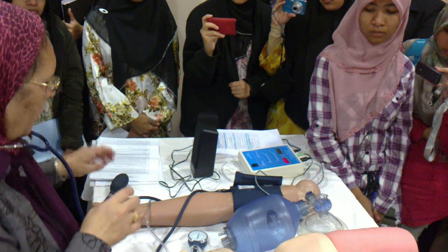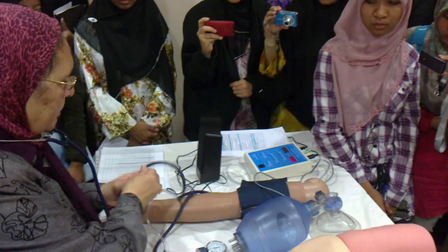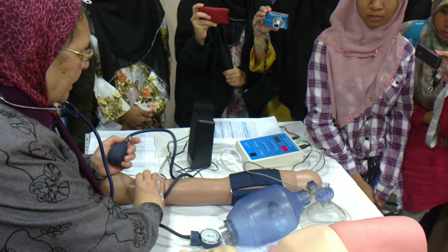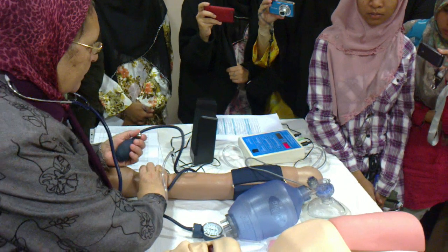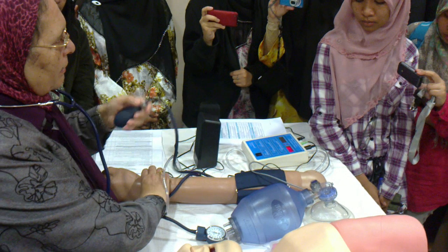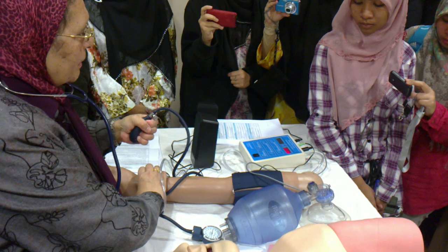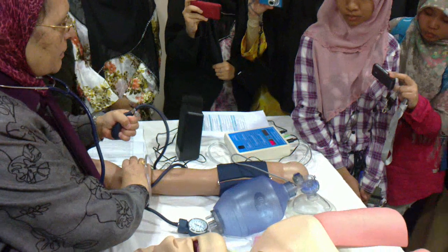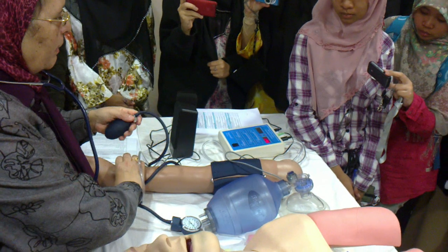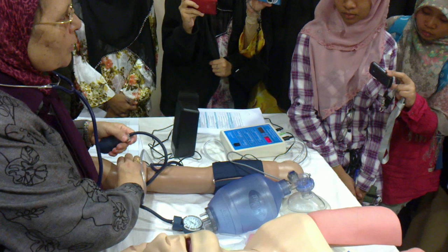Okay. First of all, I will feel the radial pulse like this. I feel it, and then I will close up and elevate the pressure till it disappears. Okay, it disappears at 150, and I have to elevate 20 to 30 above it.